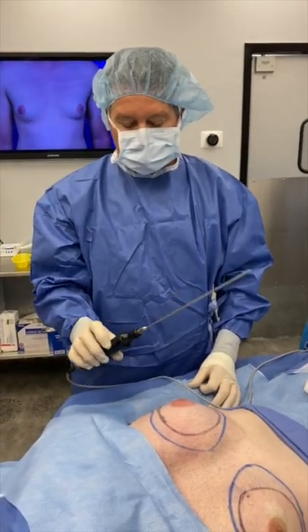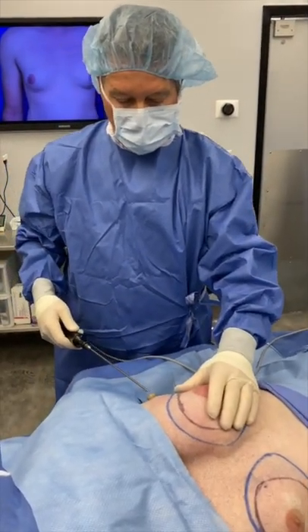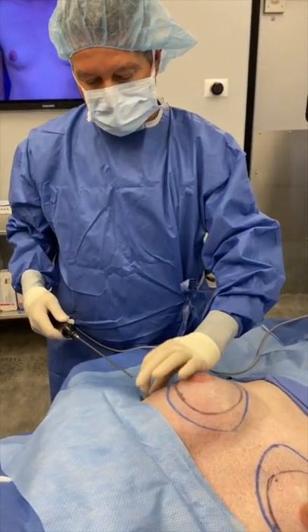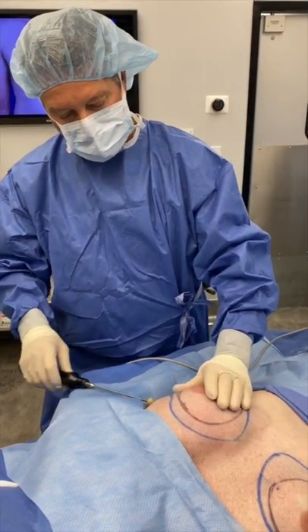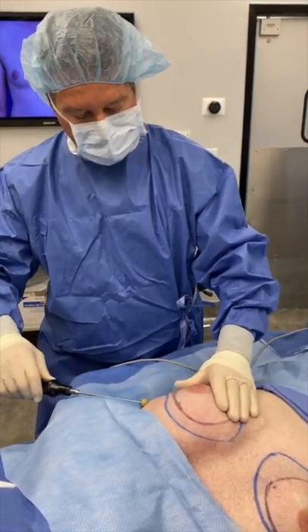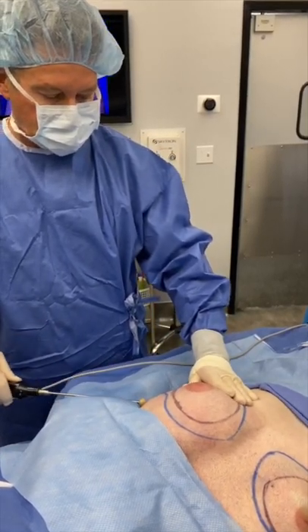Step 2 is the use of the ultrasonic liposuction system — in this case, this is a VASER system. Through the tiny stab incision I put a skin protector and I will use the VASER system to circumscribe the area of gynecomastia.